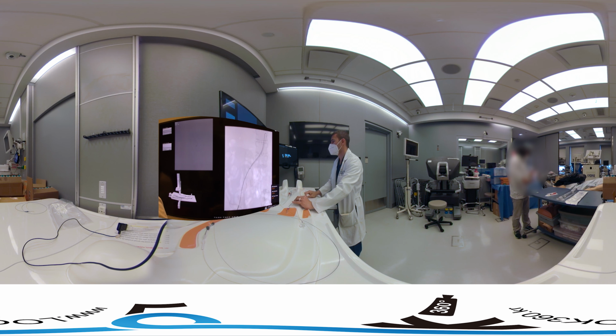There we are. I'm going to turn the catheter just so we're facing the other way so that we can pull into that ipsilateral. Push up just a little bit, and right here is where the ipsilateral comes off. We'll get a catheter in there, and then we'll get a wire down there, and we'll pull down into this. So we'll pull everything down over the wire, right there, and that gets us right into where we want to be.